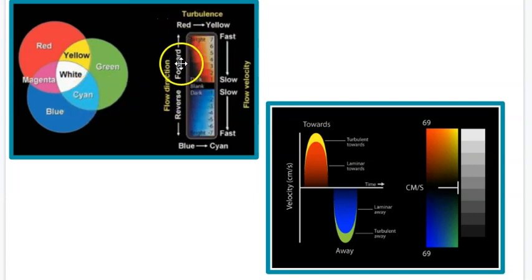This would be a variance color map that we really don't use. We did demonstrate we have a bunch of color maps to use, and we typically use color map 1 or 4, something like that. The variance map isn't used too much in most places I've worked, although probably in a lab setting it would be. We showed this one here, centimeters per second.